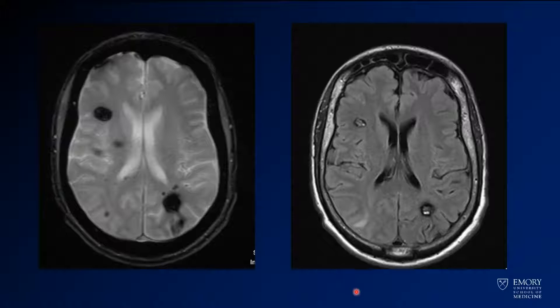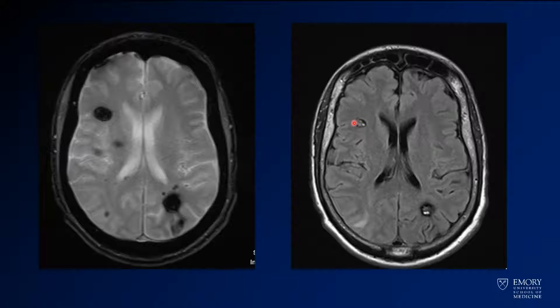Now if you look at the susceptibility — this is a gradient image, and this is T2 or FLAIR — what you have is multiple lesions with rims of dark hemosiderosis. Centrally they're T2 bright. Those are a classic appearance for cavernomas, so you definitely want to think about that.